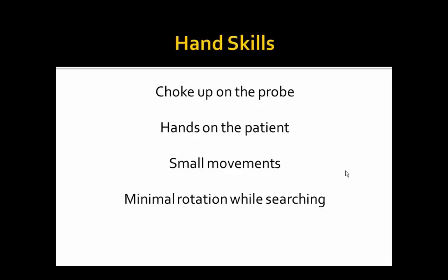So important, again, our students currently on the clerkship haven't done a lot of ultrasound, so I want you to realize, and you'll see this when we do some workshops, how you hold the probe and how you apply it to the patient's body is actually very important. It seems like a small detail, but it will make you a better scanner if you do it right. Choke up on the probe, hold it down right towards the end that touches the patient. Your hands should be on the patient. If your hands are not on the patient, you're going to have a lot more difficulty, especially with the heart.